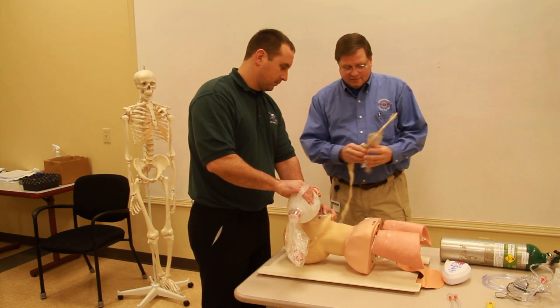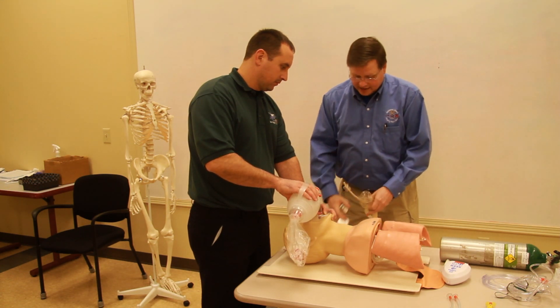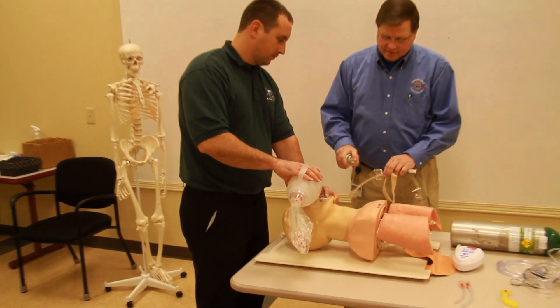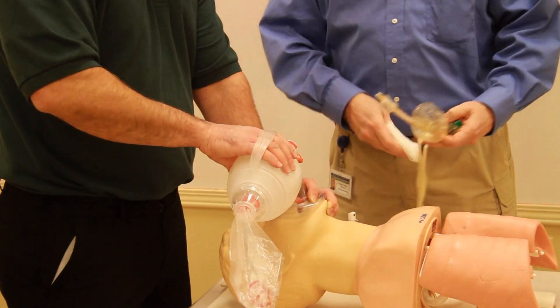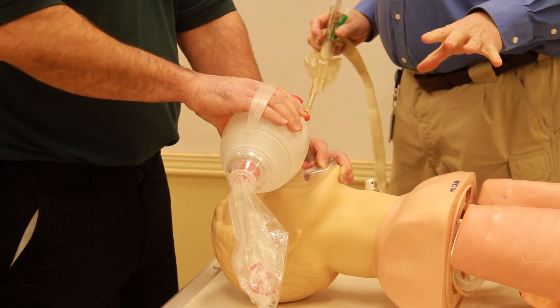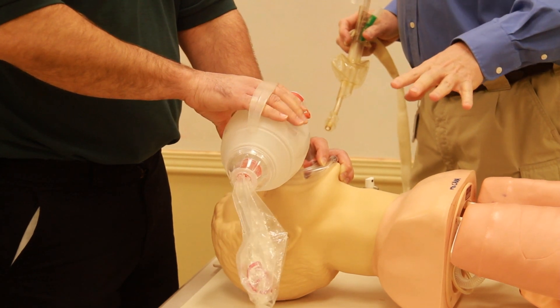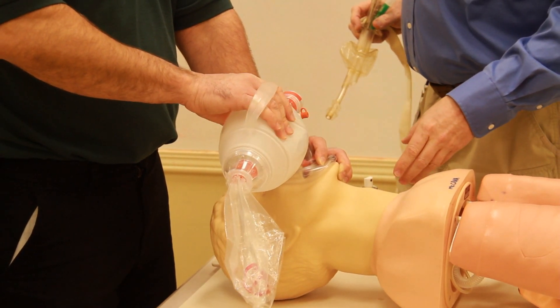Now it's a matter of applying water-soluble lubrication to lube up the airway. Then I have my partner hyper-oxygenate the patient for about 30 seconds and remove the oropharyngeal airway.